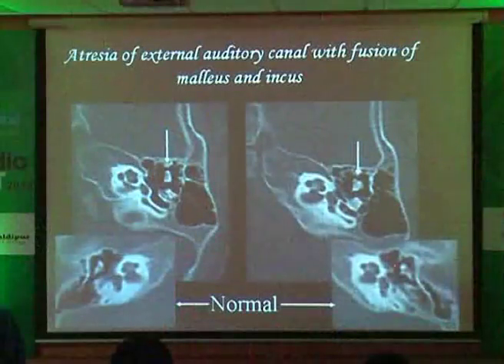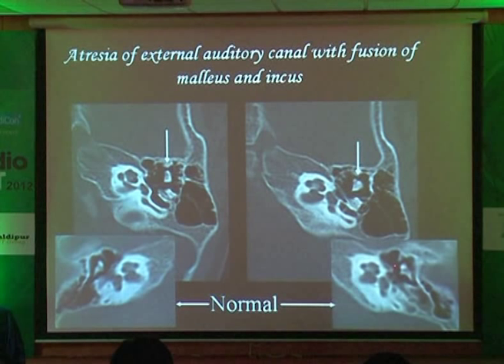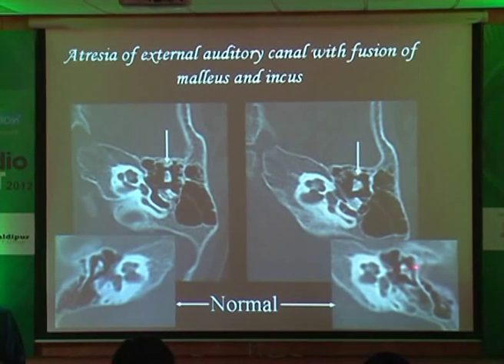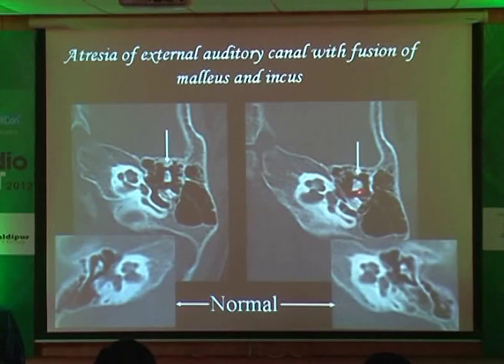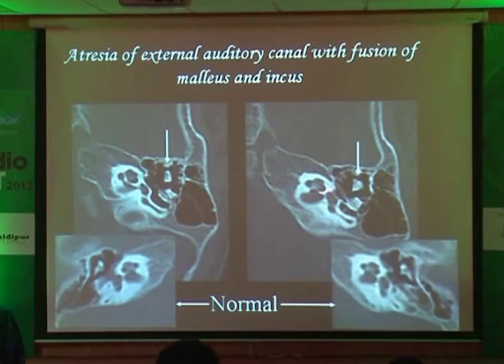This is the normal below. As Manoj rightly said, we call this the ice cream cone appearance. You have the malleus anteriorly, incus posteriorly, the incudomalleolar joint — classical ice cream cone appearance. This black hypodense line is the joint. But look at what has happened here: the whole anatomy is lost. You don't see the ice cream cone appearance, you don't see the incudomalleolar joint — you just see fusion of the incus and malleus. This is the cochlea, with all the turns beautifully seen.